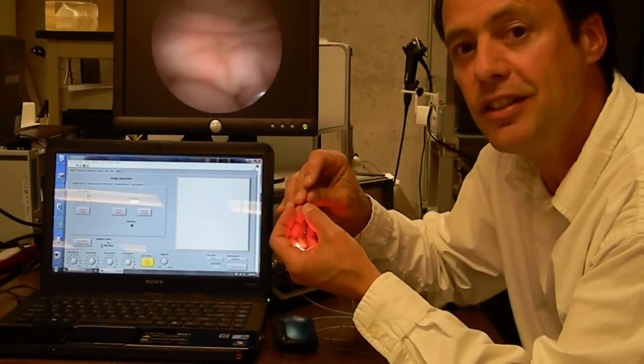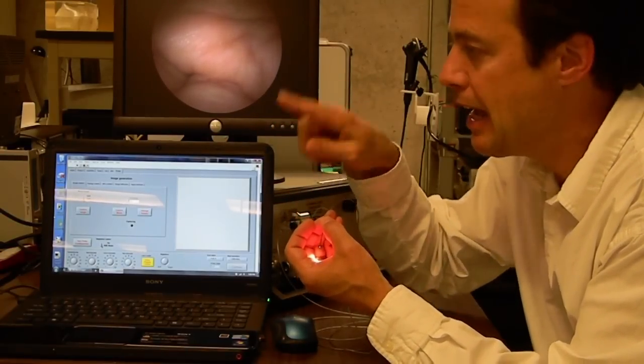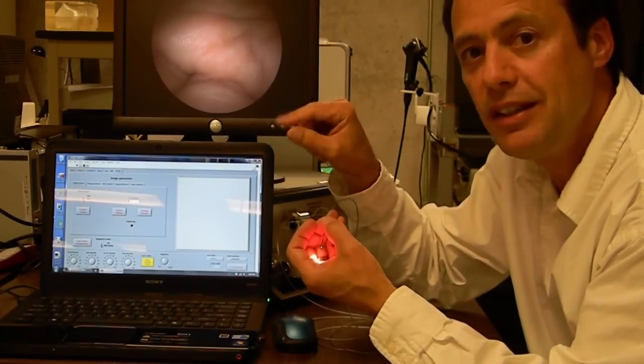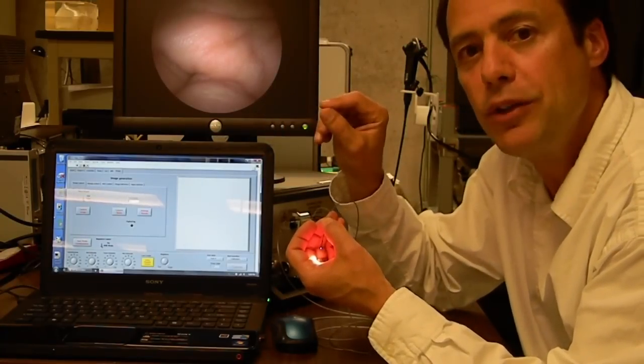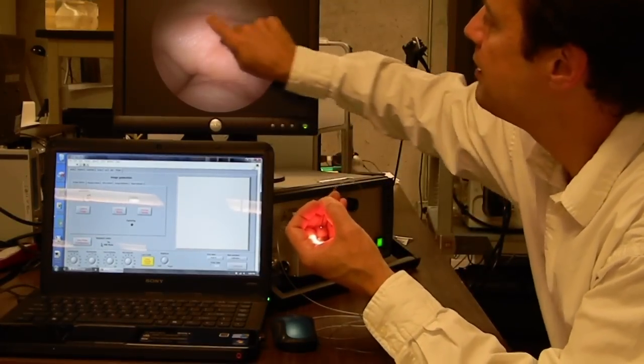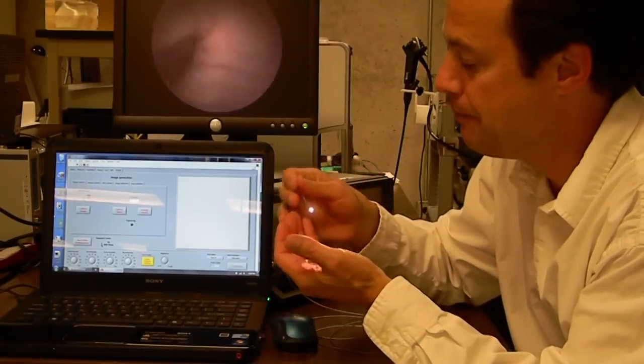Images are formed one pixel at a time at megahertz rates as this illumination fiber is scanned by a piezoelectric actuator at about 12 kilohertz, 12,000 times per second. So it's scanned around 12,000 times per second, forms 30 frames per second images.